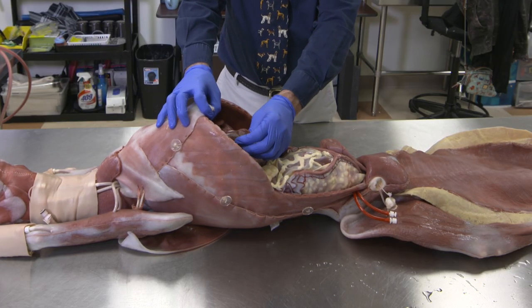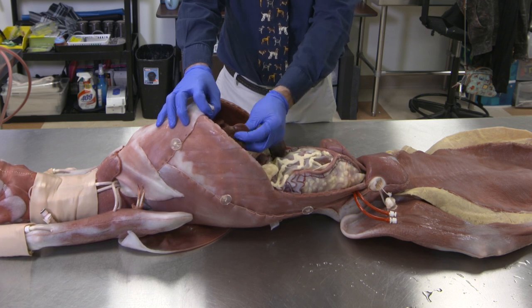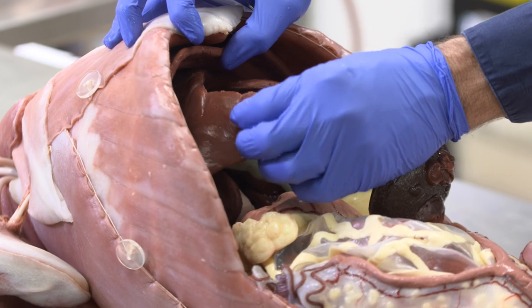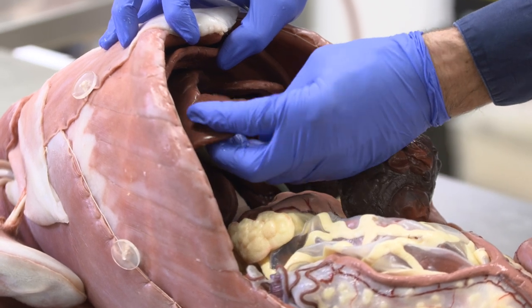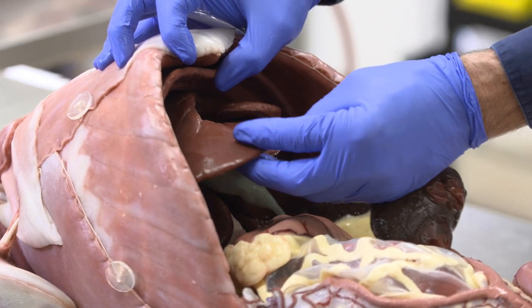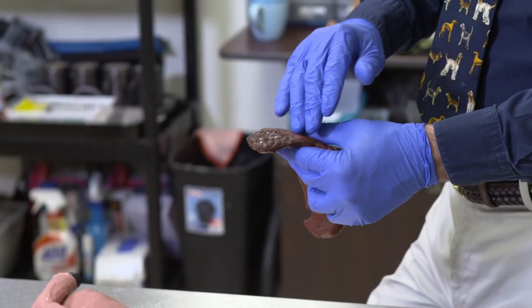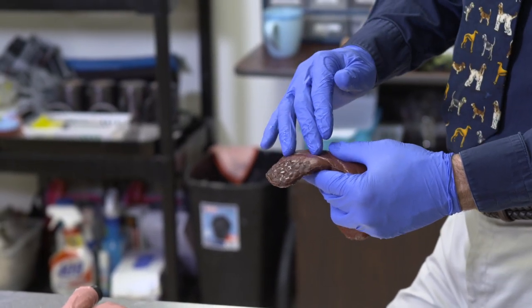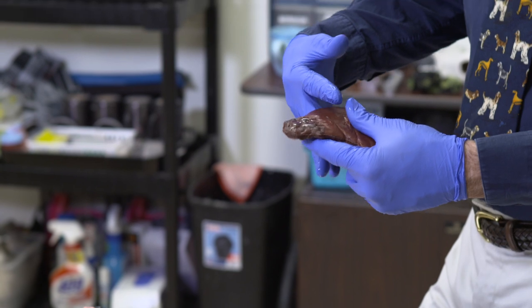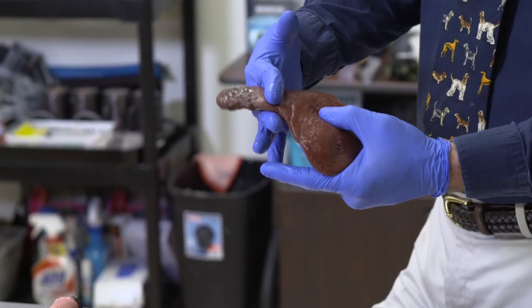We've designed this so that you have repeatability. The organs that are interfaced are replaceable. Specifically, this right medial liver lobe, which is the first organ, is vascularized so that it will bleed. It allows practicing biopsy on it. They can do several procedures — both punch biopsy and ligation biopsy. You could also do a partial lobectomy where you could remove that as well.